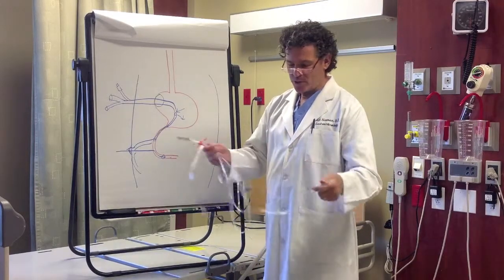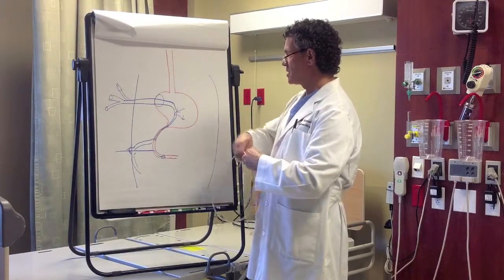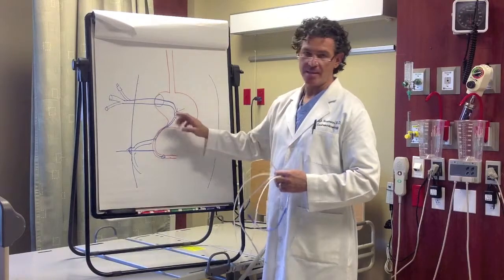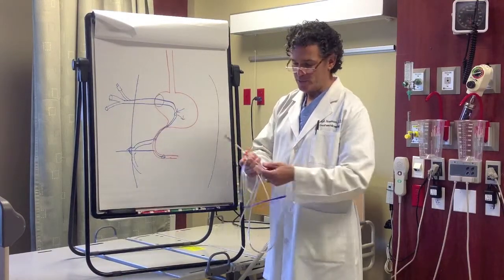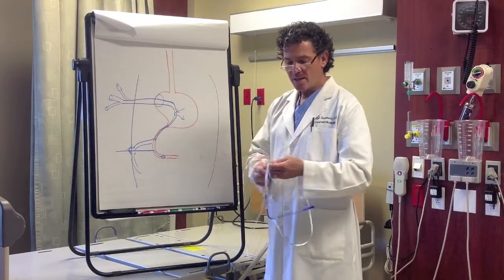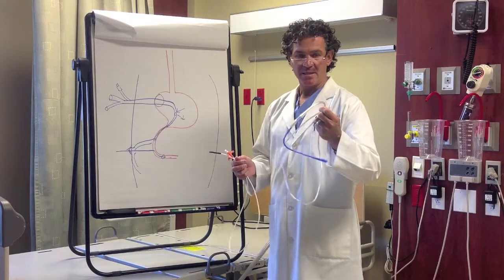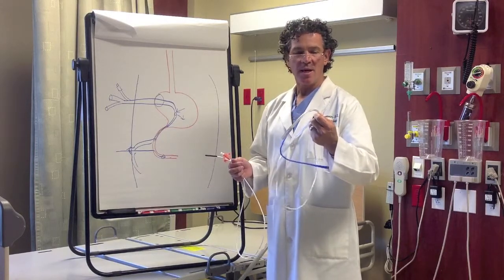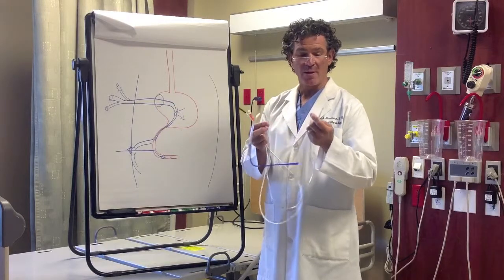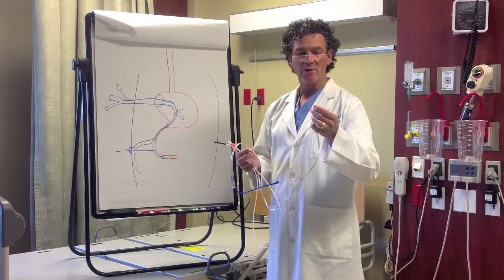The NG tubes are designed, the nasogastric tube, basically to go through the nose, into the esophagus, and into the stomach, and sit in the stomach. Okay, and I know that I'm stating the obvious, but just to review things. These tend to be a little bit larger in caliper. They don't get clogged as easy. You can put medicines through these. You can put thicker tube feedings through these. They're more rigid. They're more uncomfortable. They're a little bit easier to place because they're bigger and more rigid.